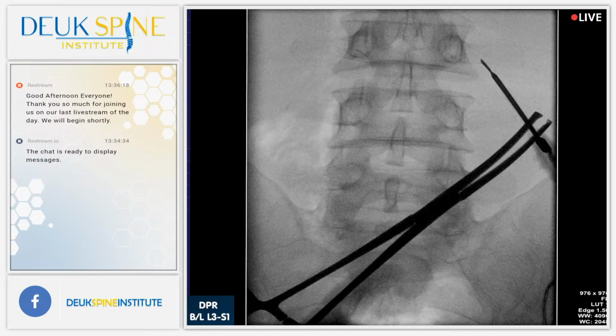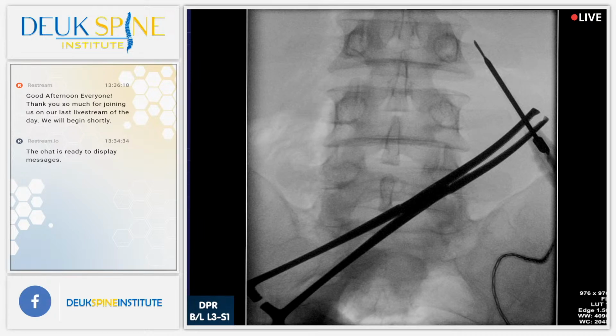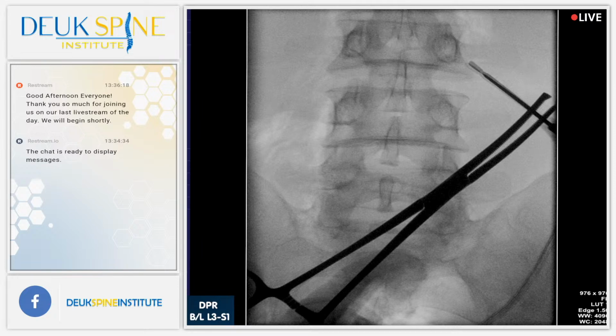Just the slightest movement. It's so strange because his TPs look fine on the x-ray. And then you get here and they're so hard to tag. It seems to be helping.